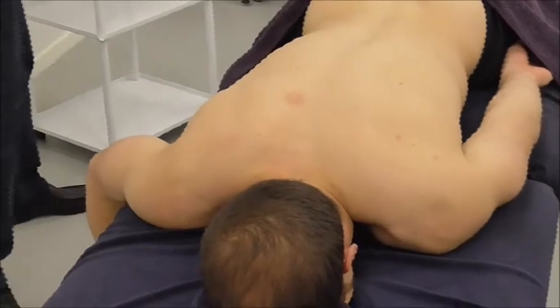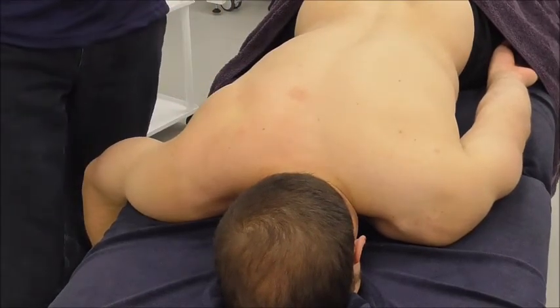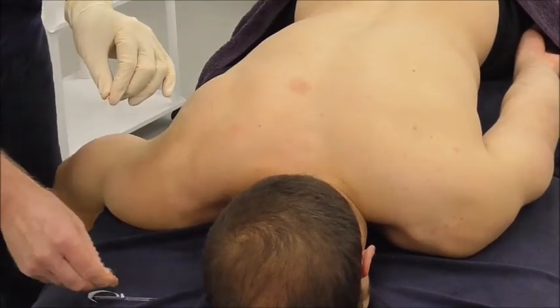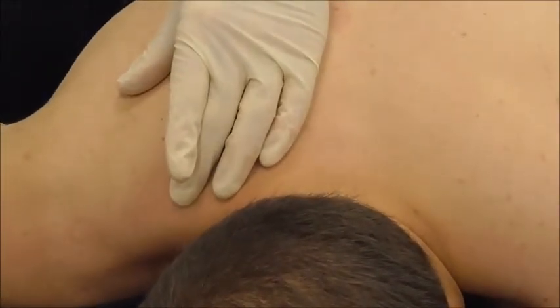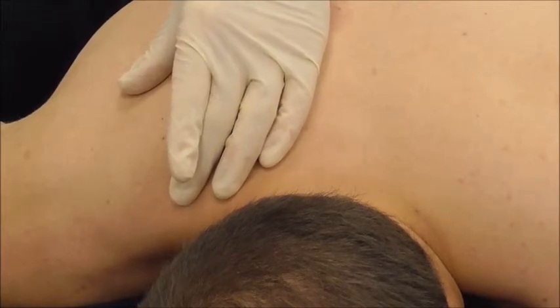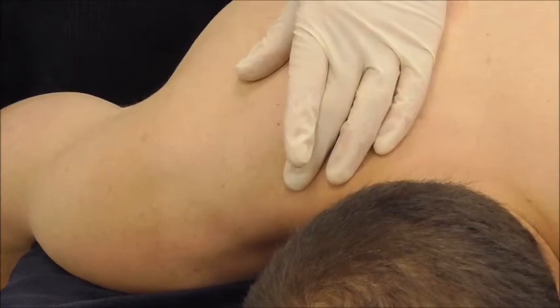I'm going to use some gel on the area. I've chosen a needle appropriate to the body area — I'm using a 30mm needle, and he's an athlete. For an elderly subject you might choose a smaller needle; for a particularly large subject, you may need a longer needle. You need to judge thickness because we're manipulating the needle. I'm using a 0.22, which is quite thin — if the needle is bending too much, you might choose a 0.25.